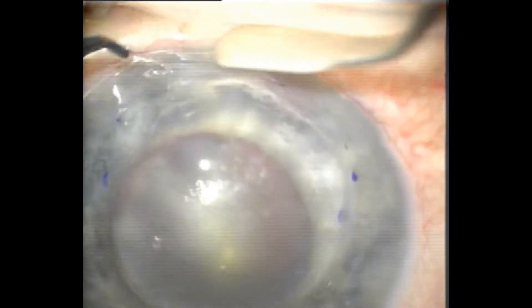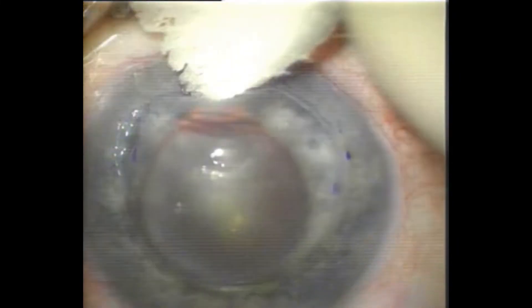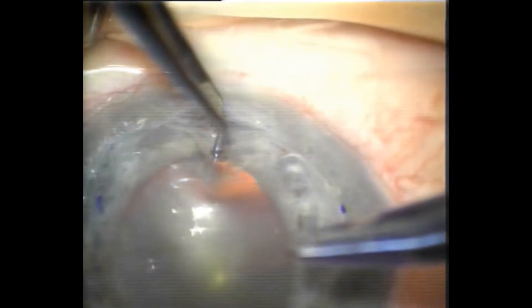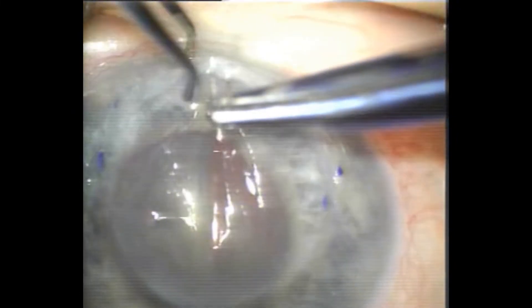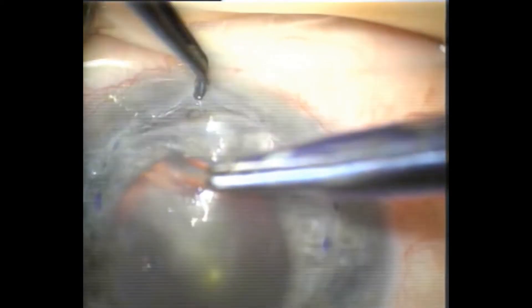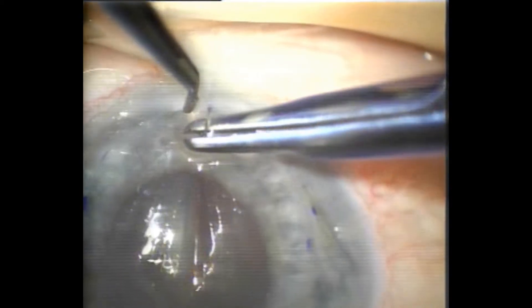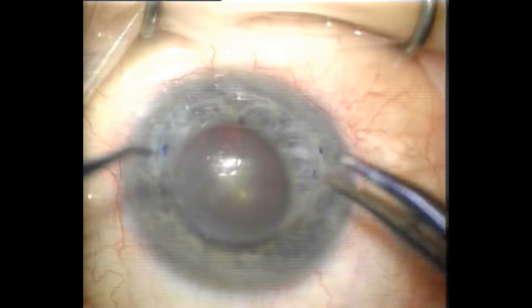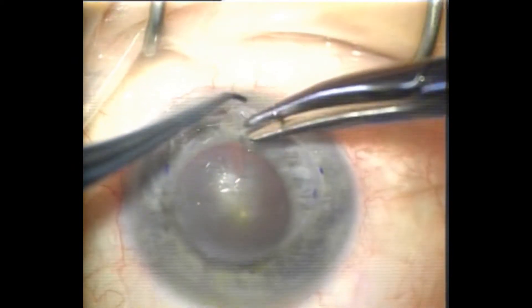And again, inadvertently getting to the AC there with a gush of fluid. Starting the suture in the centre or near the centre of the incision, trying to get quite deep and long with the suture, so doing it in two passes. And tying this tighter than you'd expect from the appearance.